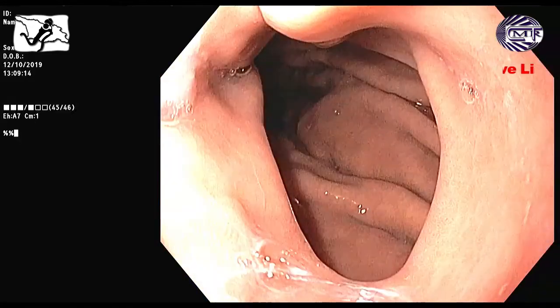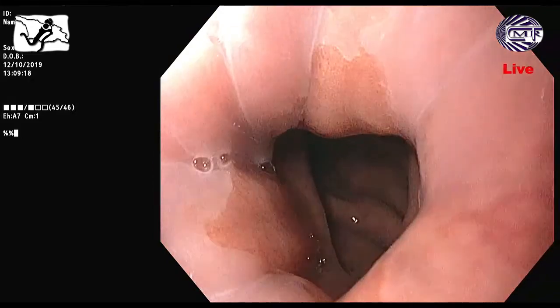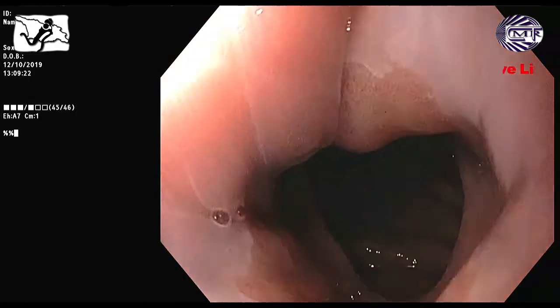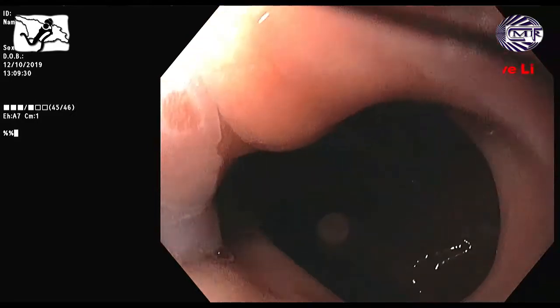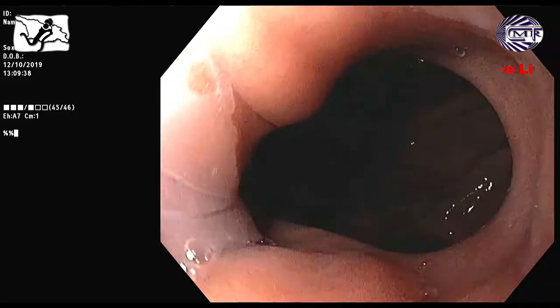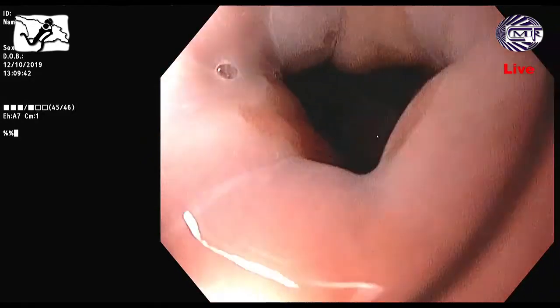This patient suffered from early morning heartburn and pain. Pain, right? Yes. How about the esophagus? Right? A little bit of mucosal change, not severe reflux, right? But reflux disease shows several kinds of phases, right? Sometimes severe esophagitis, but sometimes not, right? This patient is not severe.